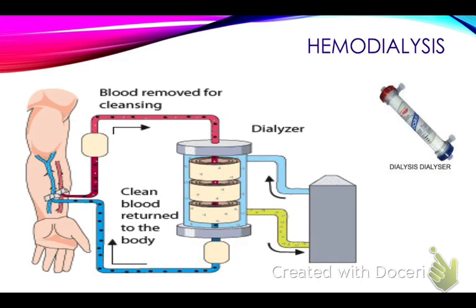All right, let's talk about hemodialysis. With hemo, you've got 2 needles, as you can see here. I like this picture just because it's a little more visual for me. I'm a visual person, and this picture shows that with hemo, you've got the 2 needles. This is your hemodialysis patient that is going to your clinics.